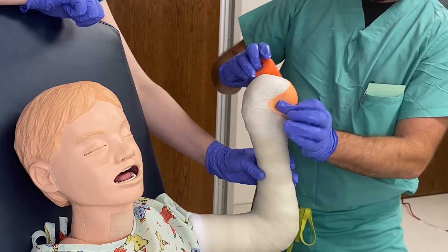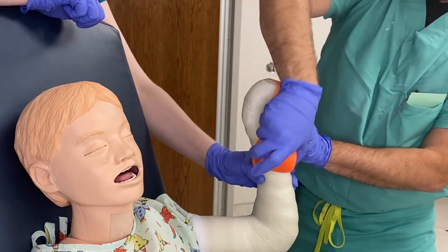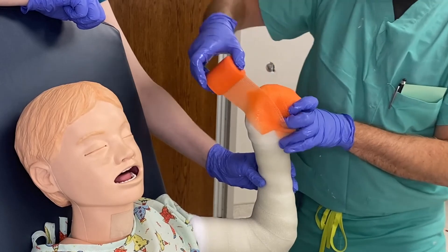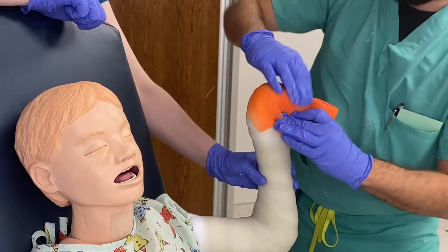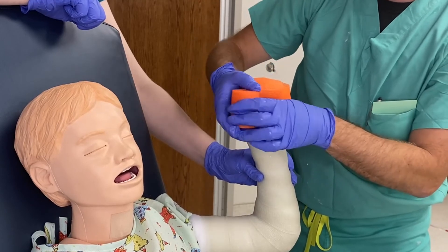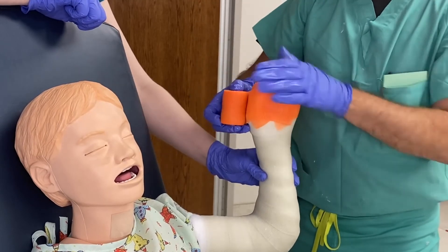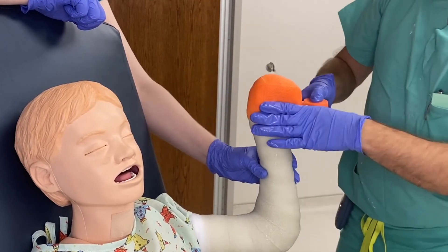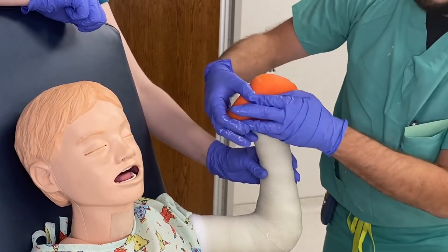Now for the color layer, go ahead and do the fan fold method — just back and forth — and then going down. You don't need a lot of layers for this; it's just two layers of color, which ends up being five total. Except right here at the hand this is six layers, but the rest of the cast is five.